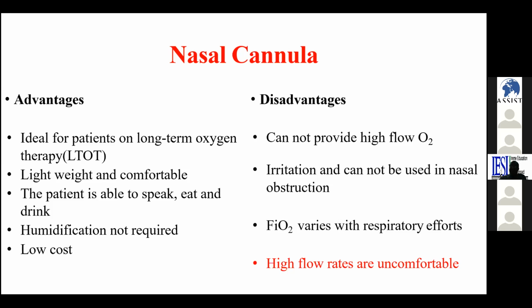Another is that it can irritate the airway membranes. And as I told you before, the FiO2 from a nasal cannula will vary depending on the patient's respiratory effort. So when you put a patient on high flow using a nasal cannula, for sure the patient will be uncomfortable. We'll see later. So next slide.